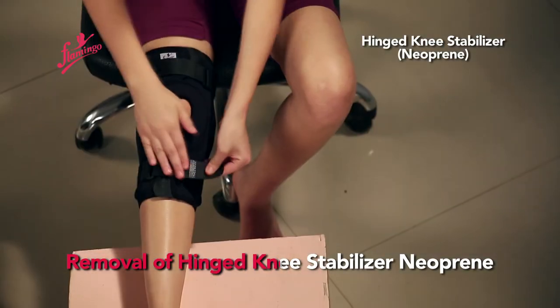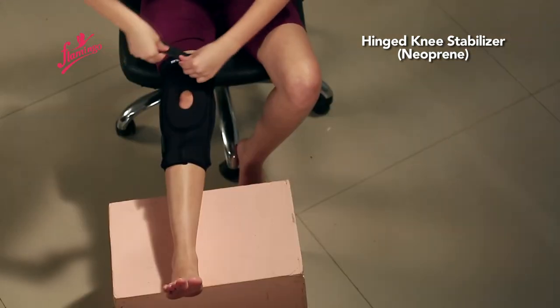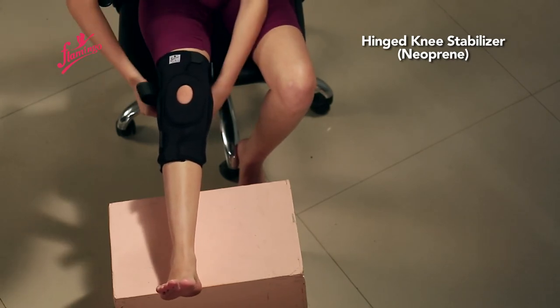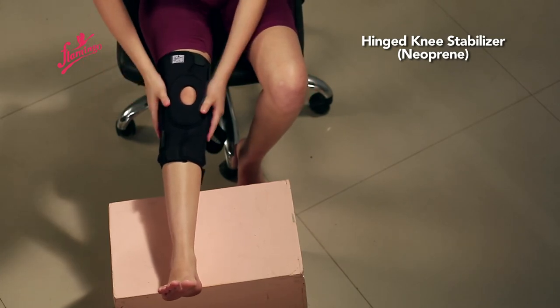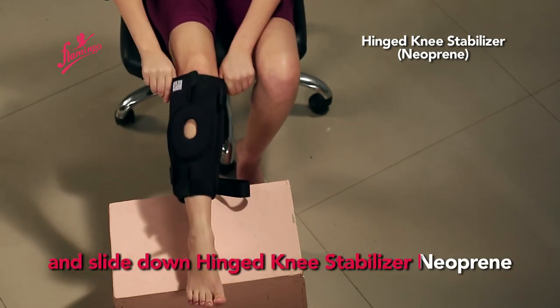Removal of Hinged Knee Stabilizer Neoprin: begin unstrapping with the bottom strap, then the top strap. Unfasten the hook and loop and slide down the Hinged Knee Stabilizer Neoprin.